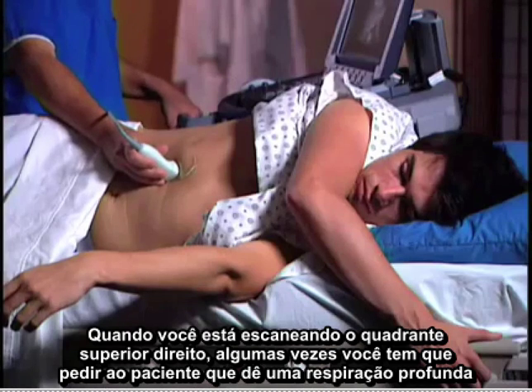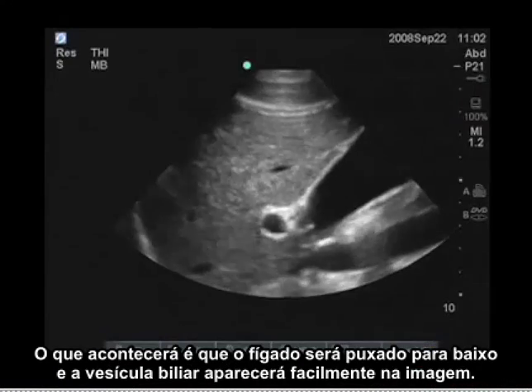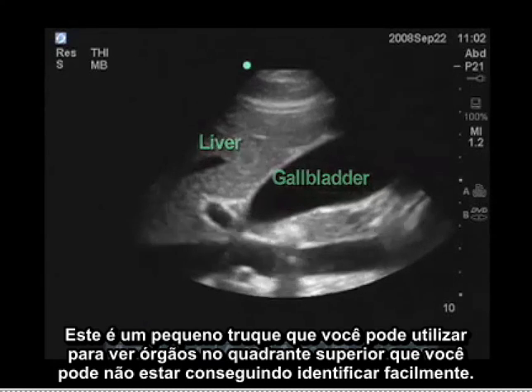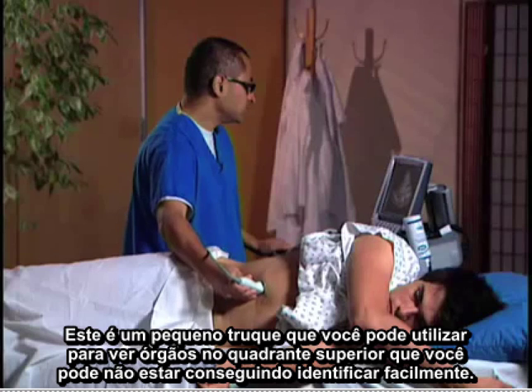When you're scanning the right upper quadrant, sometimes you'll have to have the patient take a deep breath. What will happen is the liver will be pushed down and the gallbladder will come more easily into view. That's a little trick that you can use to see organs in the upper quadrant that you may not be able to identify easily.